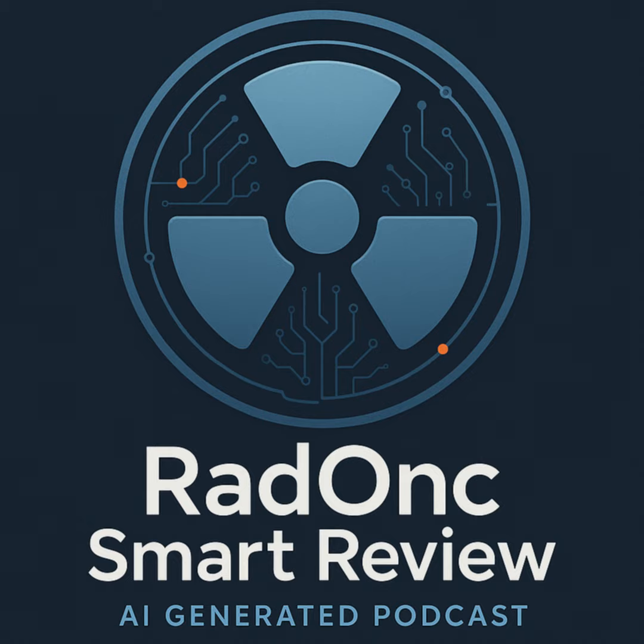PET CT fusion is a workhorse for staging and target definition in many cancers. Ultrasound's primary role is real-time guidance, especially TRUS for prostate brachytherapy. Less used for routine EBRT planning or delivery. Got it. Those are excellent summaries. Maybe let's try a quick clinical scenario, sort of like a mini case to apply this.